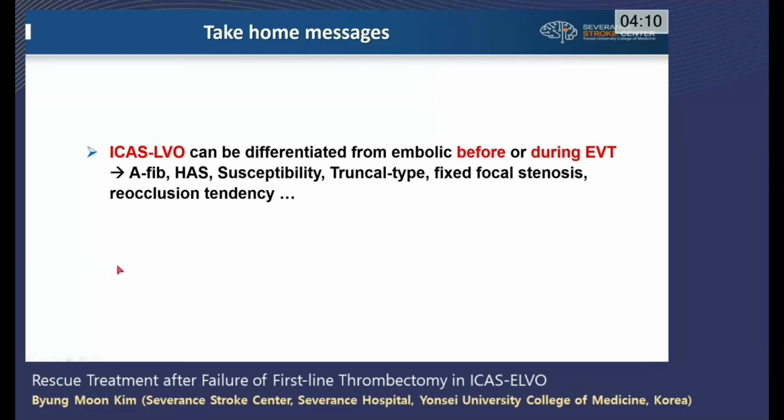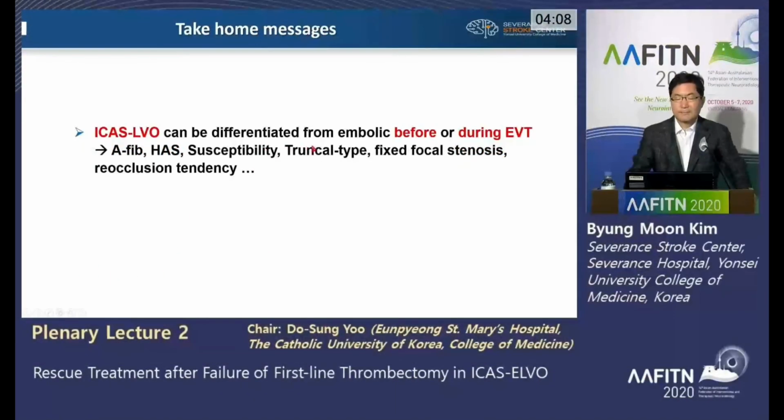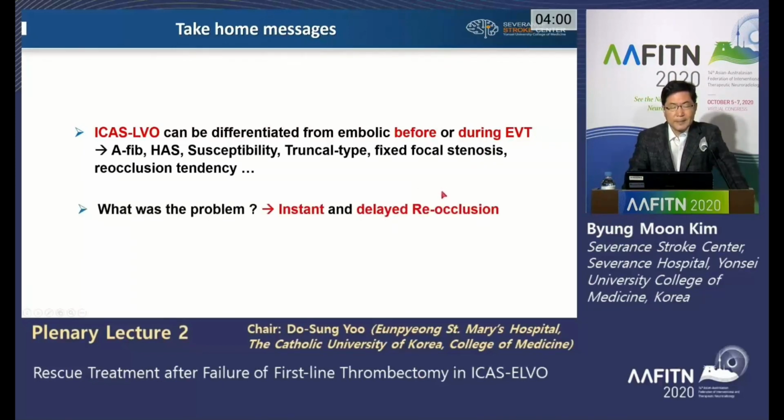Summarizing my talk, ICAS LVO can be differentiated from embolic before or during endovascular thrombectomy as lectured previously. What's the problem? Instant and delayed reocclusion.